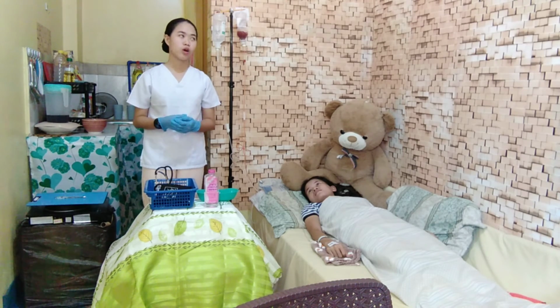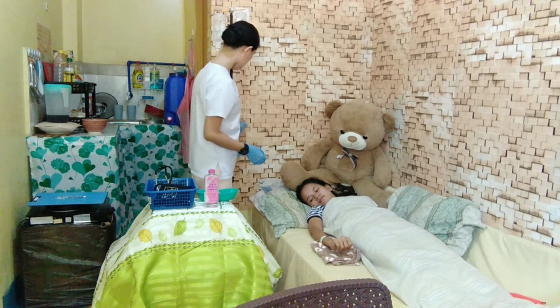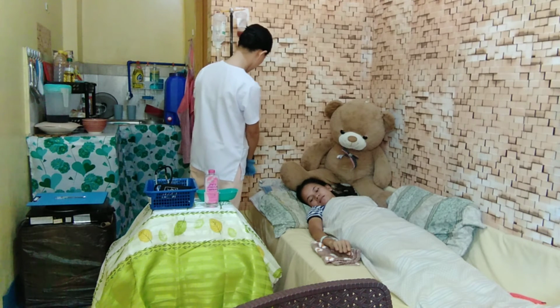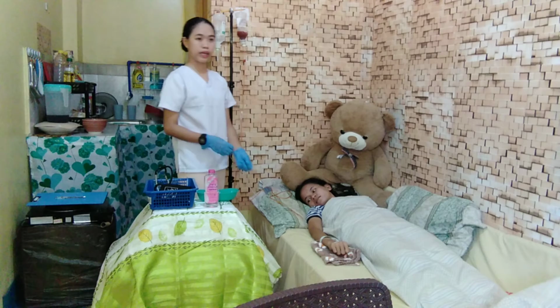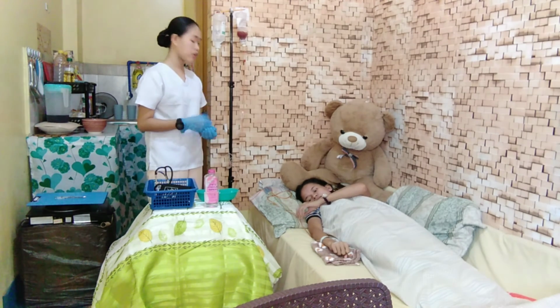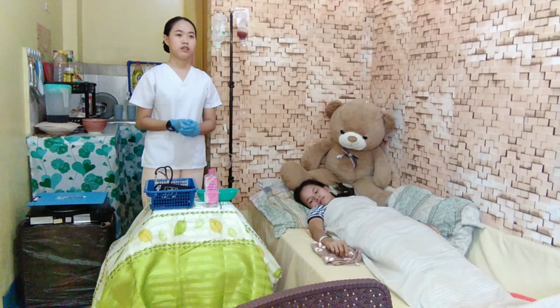We will observe for any flushing on the IV, and also if there is any swelling, itching or rash. And we remember not to mix any medication in any blood transfusion.